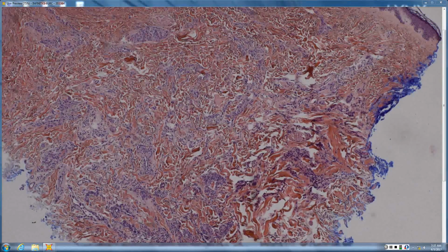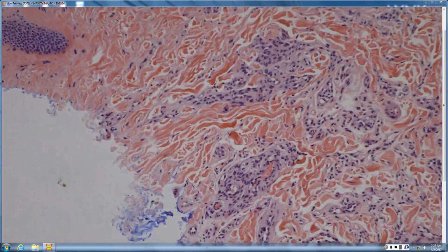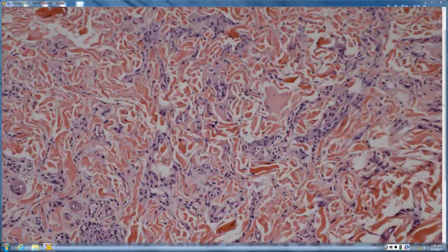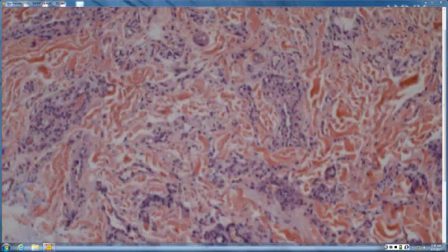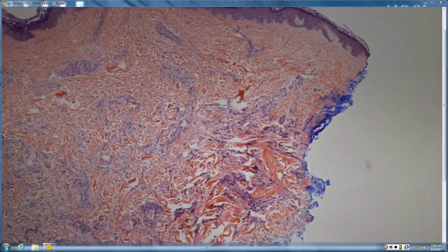Okay, so Dan, what do you see here? So, sort of a busy dermis, vascular structures. There is some hobnailing. And are these large vessels, small vessels? Small. So I was between microvenular versus hobnail. Your differential would be, it does have a little bit of hobnailing, small vessels, and could also be diffuse dermal angiomatosis, yet it's not all dissecting between collagen. These are more rounded, discrete vessels, so it's actually pretty good for exactly what you said, microvenular hemangioma. So microvenular hemangioma is another benign tumor that can mimic KS because of the small size of the vessels, but HHV8 negative.